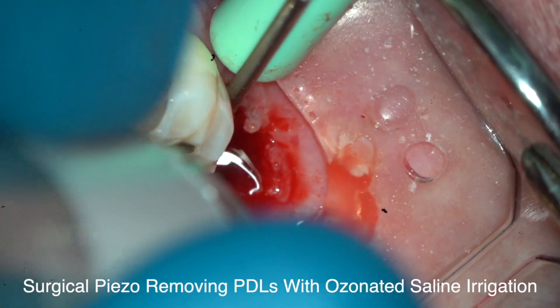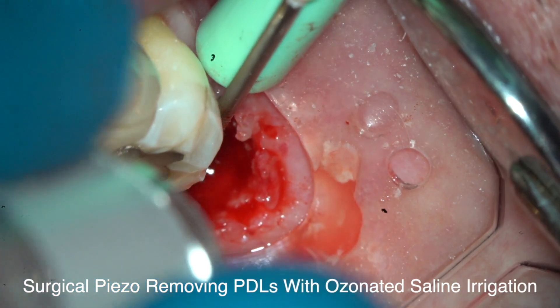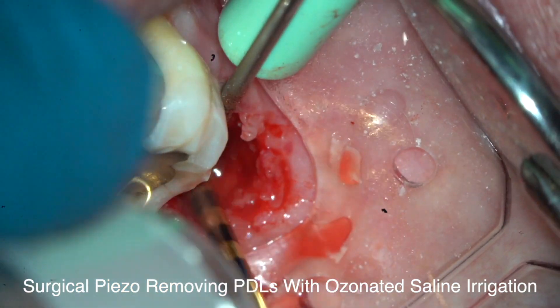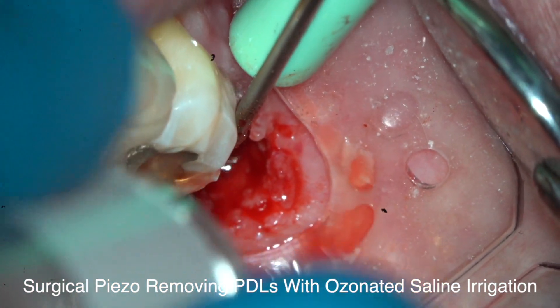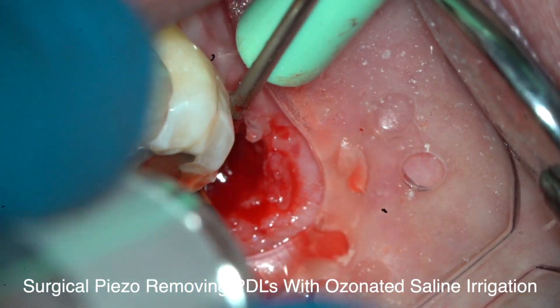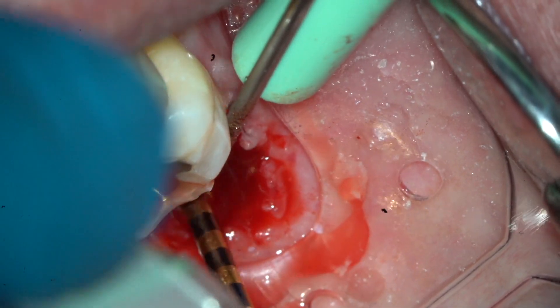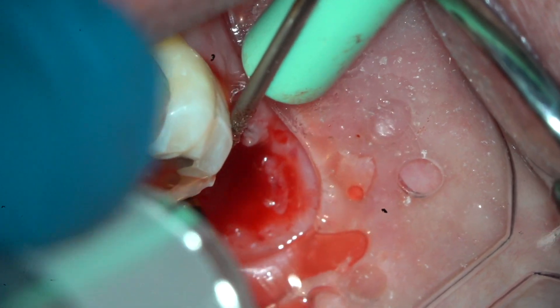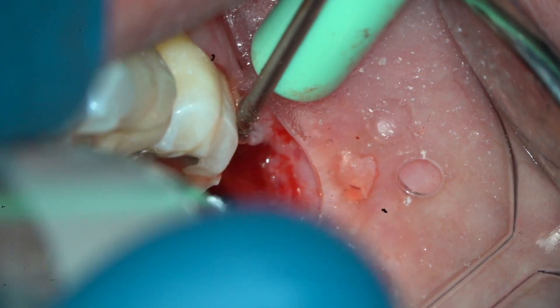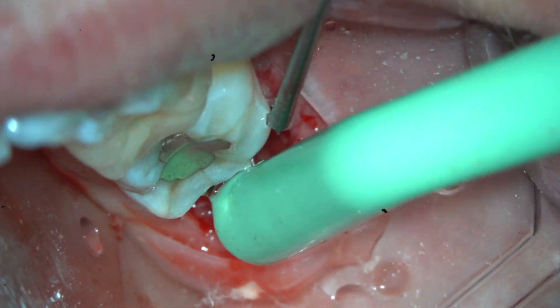There's something called cavitations. Cavitations are — when you leave, remember I was talking about those ligaments? This one, you probably wouldn't get one because it's not badly infected. You might, but probably wouldn't. But most dentists, they just take the tooth out and let you walk out the door, right? So what we're doing from here on is what really matters. This little diamond bur is going in there along the side of the wall where the root was, and I'm making sure I got all the ligaments out.